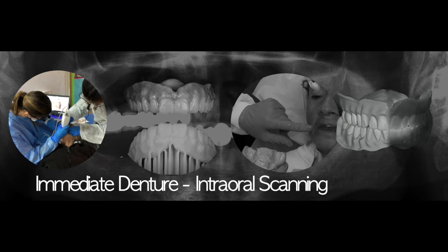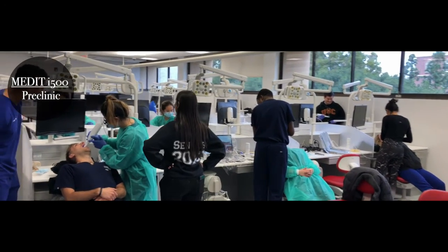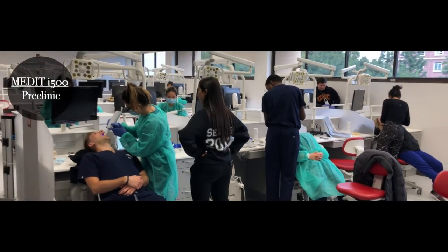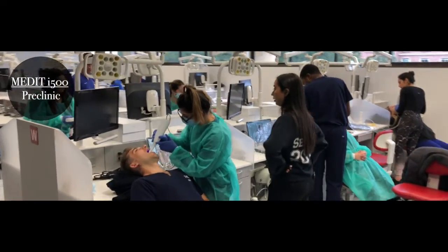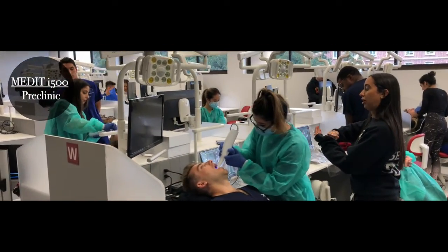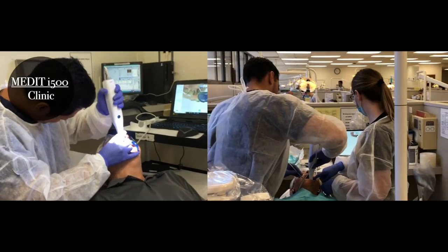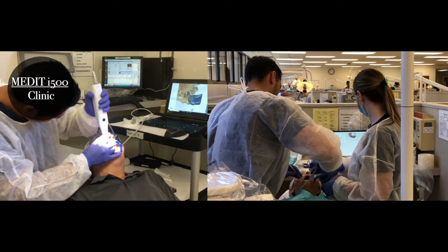So let's go step by step. First thing, intraoral scanning. Instead of taking a conventional custom tray and PVS impression, we are going to do the scanning intraorally. We teach the preclinic how to do the scanning, and you will learn it during the preclinical course. It's the same in the clinic: you're going to use the same machine, and we are scanning intraorally for the immediate case.